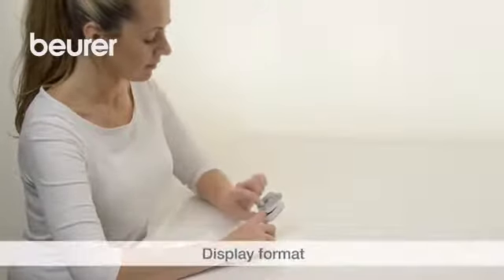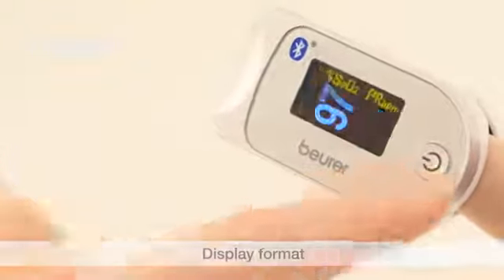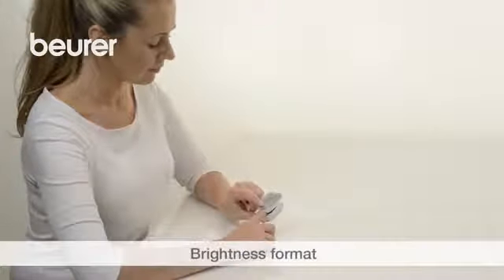Press the function button briefly to change between the different display formats. You can set the display brightness you want by pressing and holding the function button.